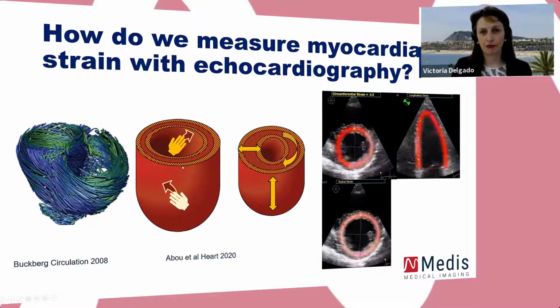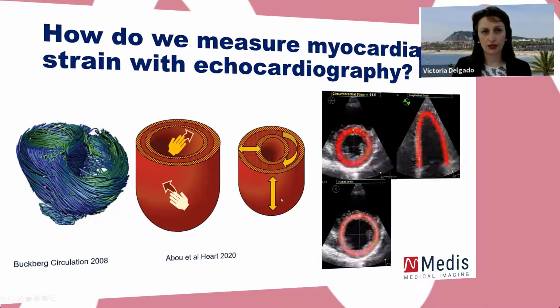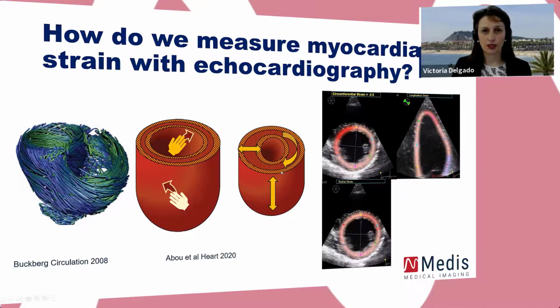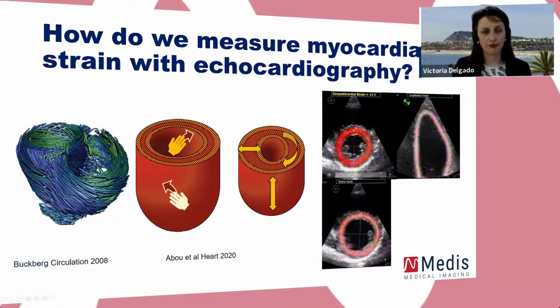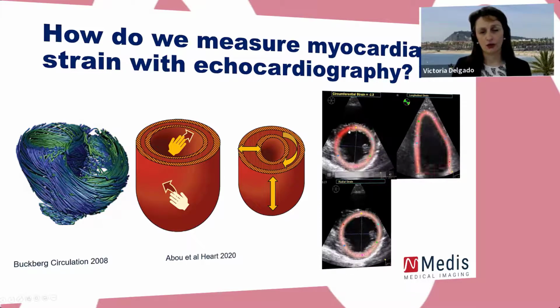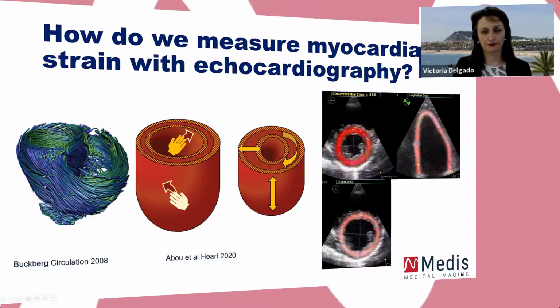By deforming these two different layers along the cardiac cycle, we have a shortening of the longitudinal direction, shortening along the circumferential direction, and through those two shortenings we have a radial thickening. Here is what we have on the images moving: the circumferential strain, the shortening along the curvature of the myocardium, longitudinal strain along the longitudinal direction, and from both shortenings we have the radial thickening.